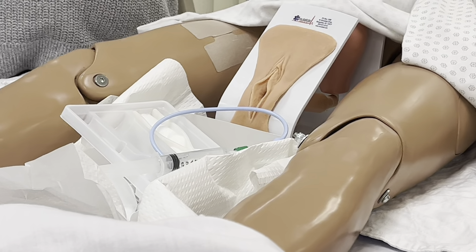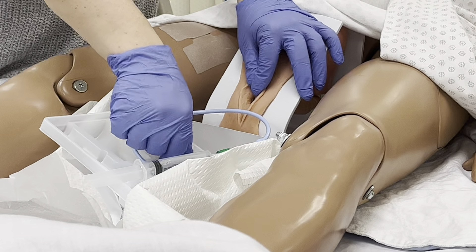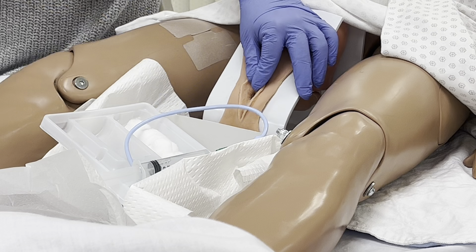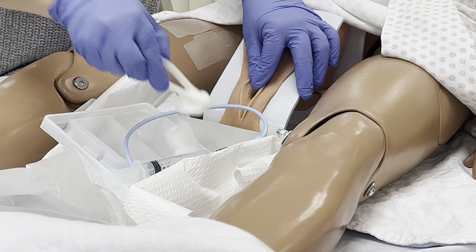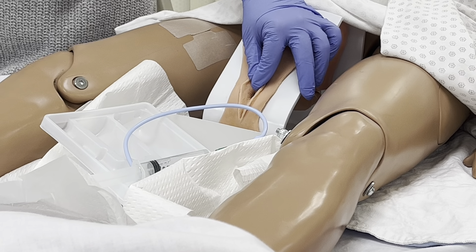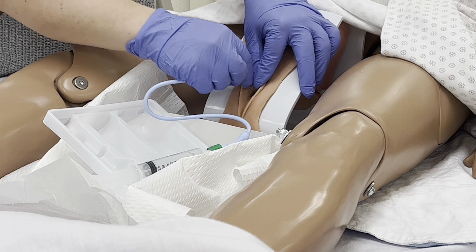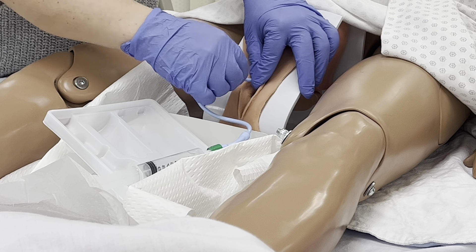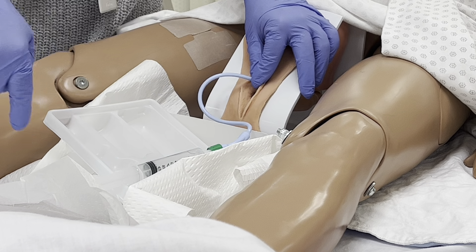I'm going to determine which is my dirty hand. I'm going to open. I'm going to take my clean hand and take my cotton balls. I'm going to swipe once — swipe on the side, swipe on the side, swipe down the middle. I'm going to pick up my catheter. I'm going to tell my patient to bear down and I'm going to insert.